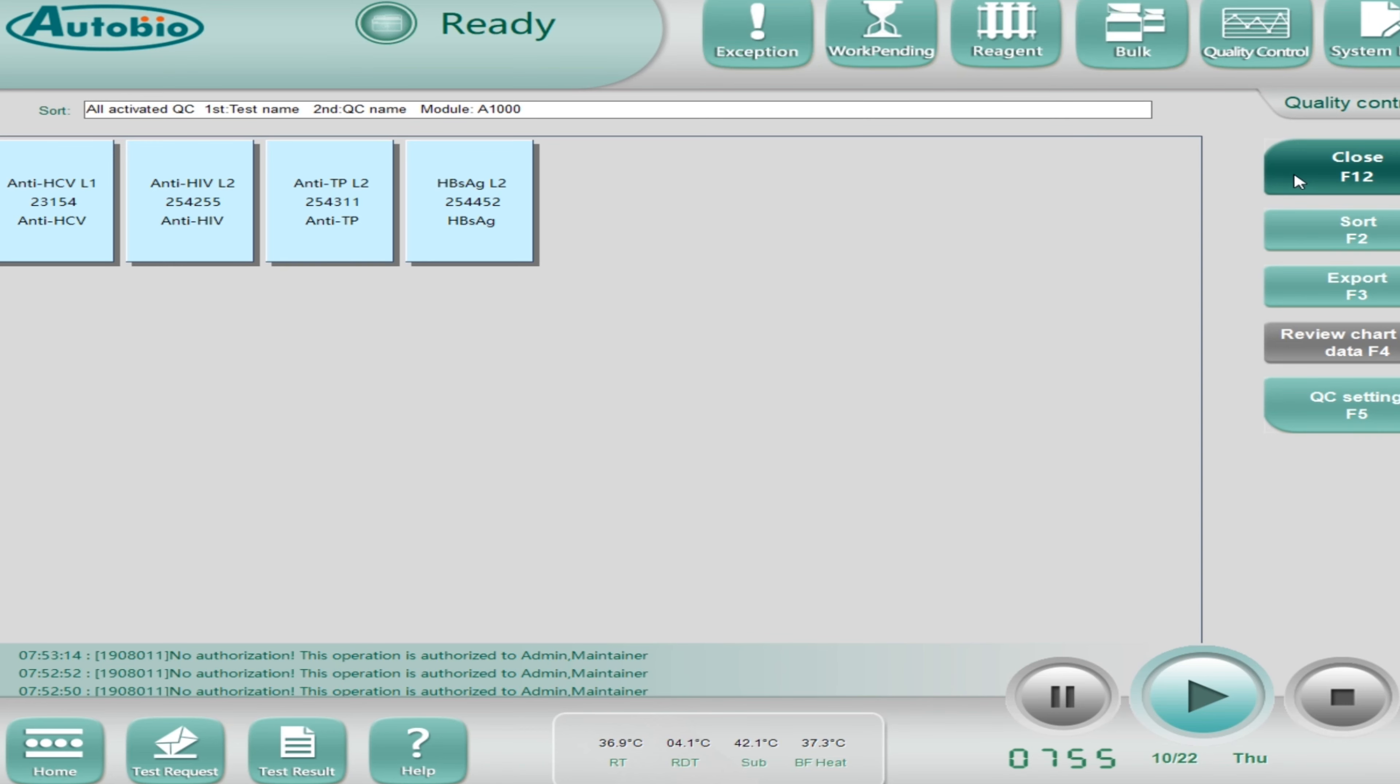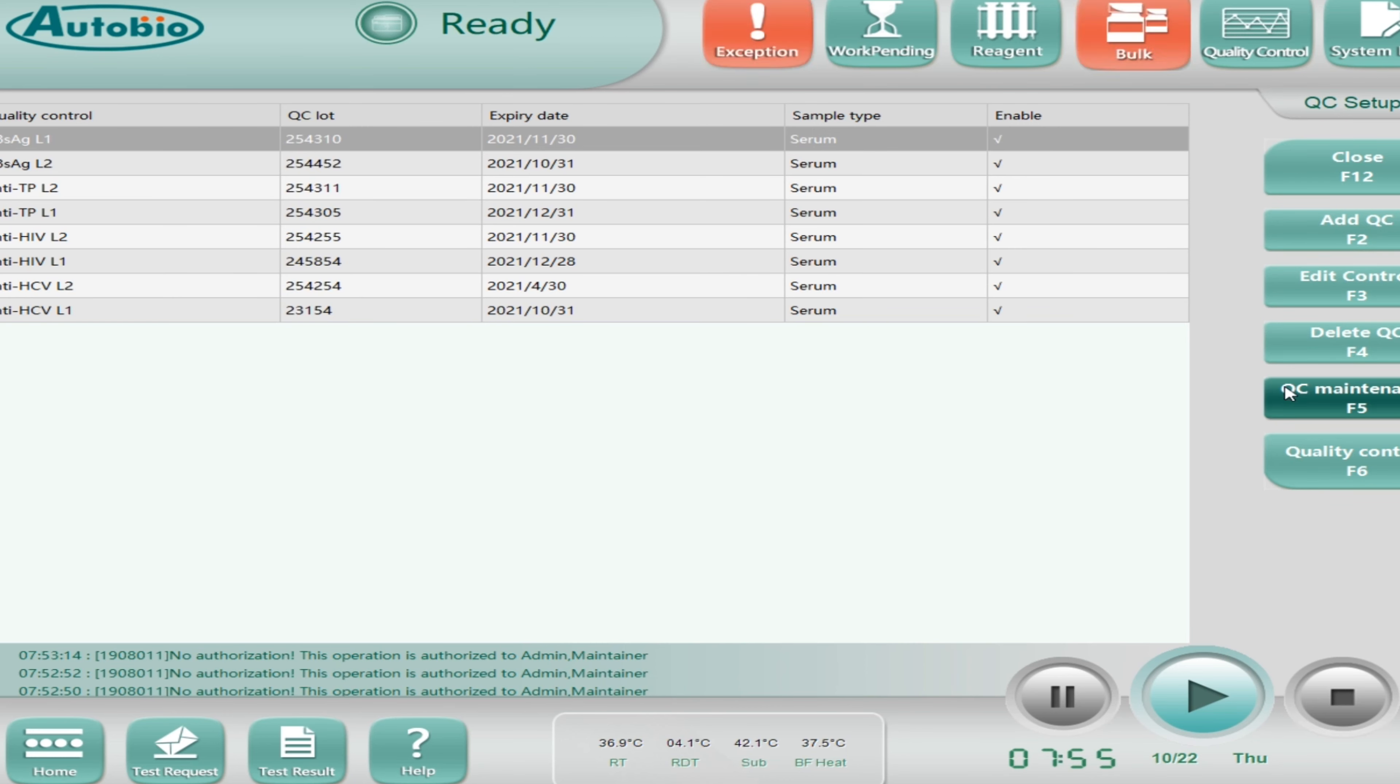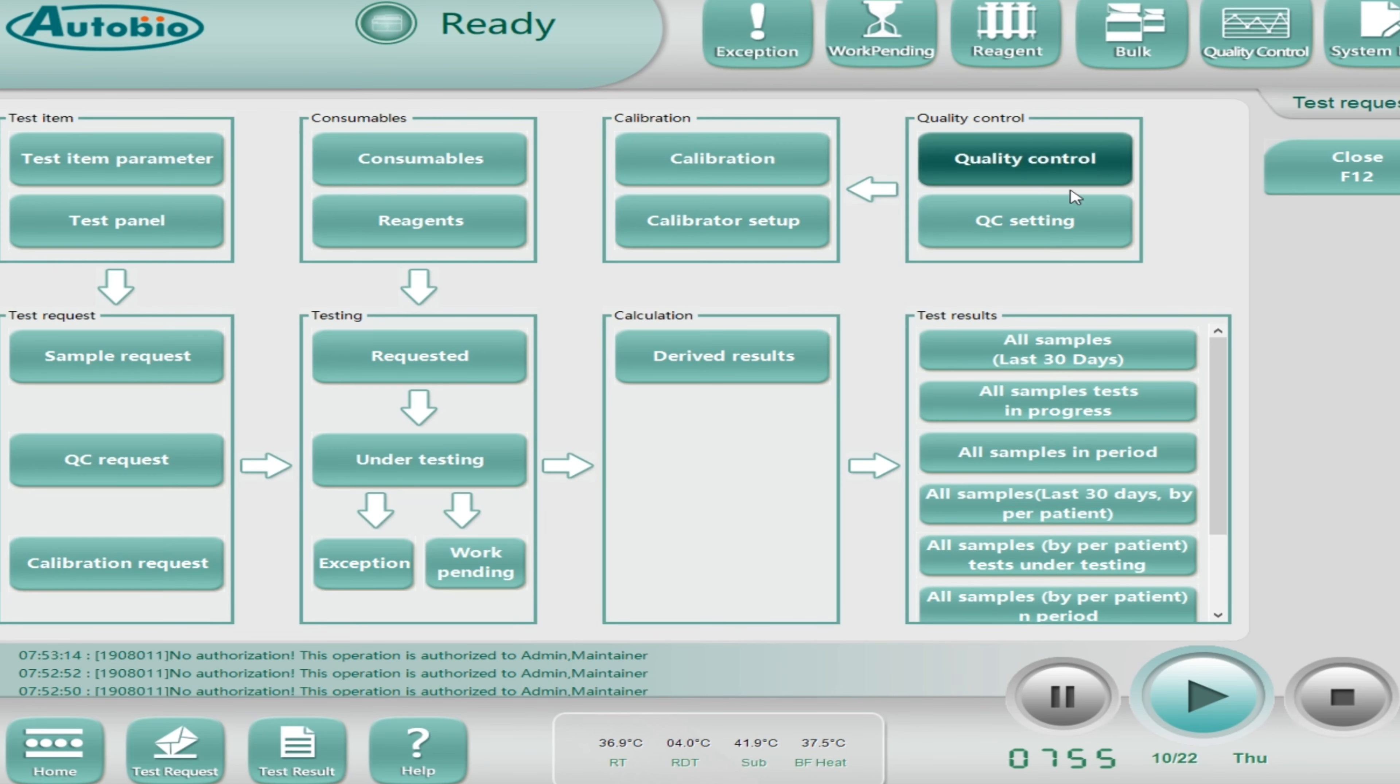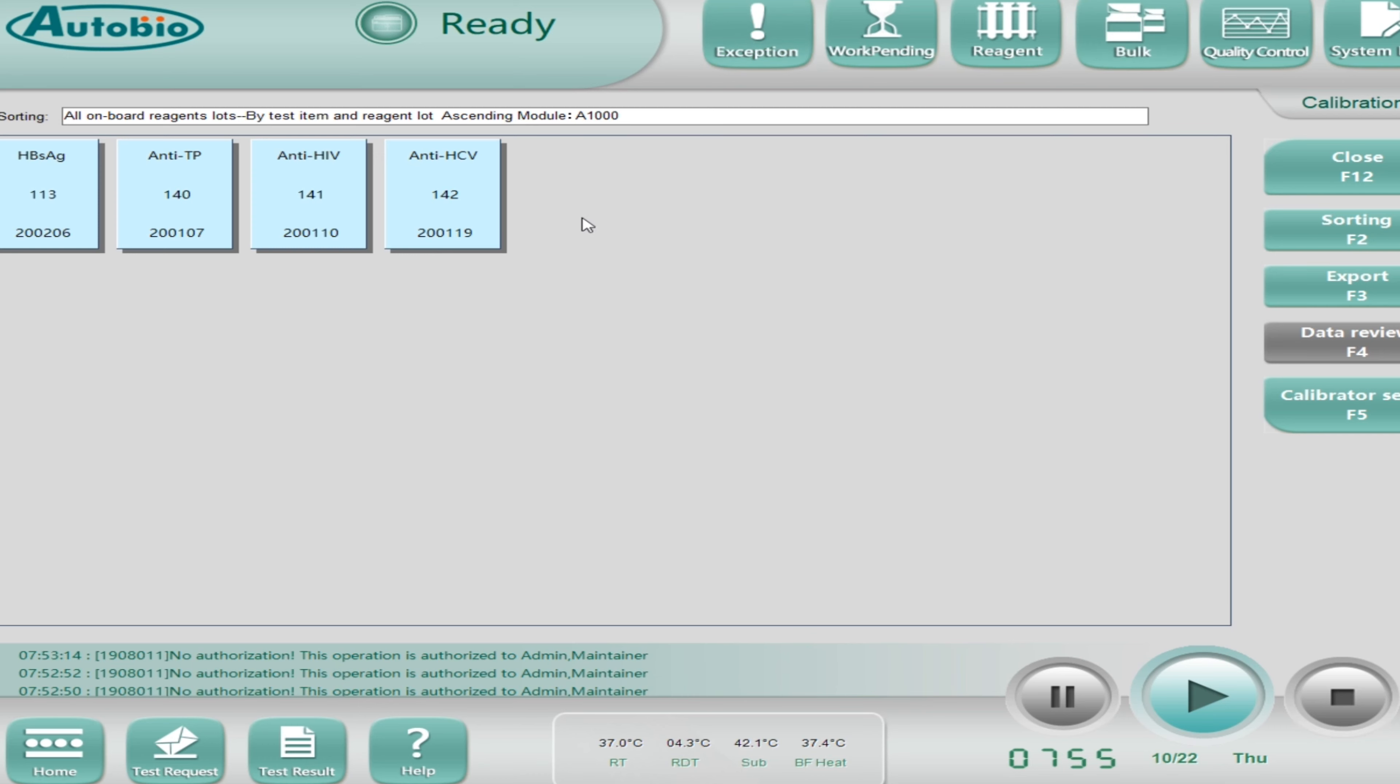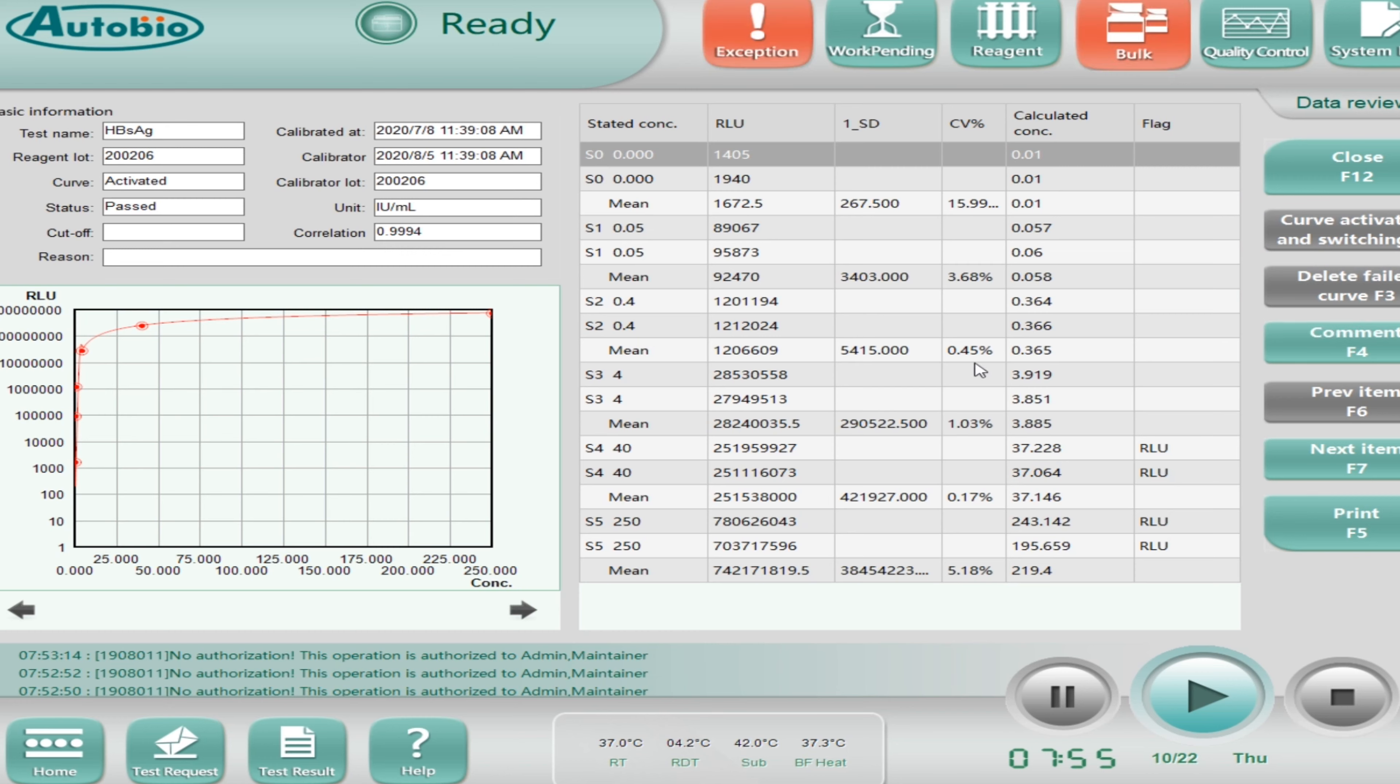Now come to the last option which is test request. In test request you will find all the options. As I told you, I will explain you quality control and calibrator later on. Now I'm going to explain. If I'll click on quality control, it is showing you these four parameters.